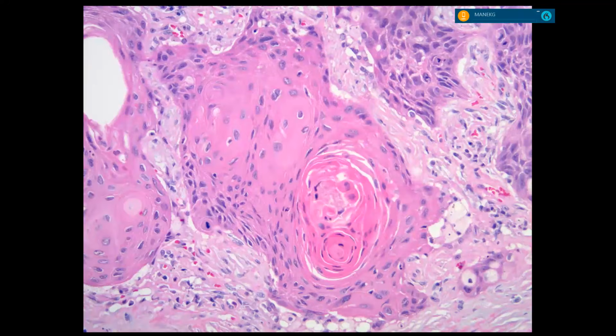Because he got it so easily, I'll end with this one. A 65-year-old smoker with a cavitary SCC. This is keratinizing, correct. So you see the difference between this? Keratinizing products. These swirly things in the middle, that's keratin.